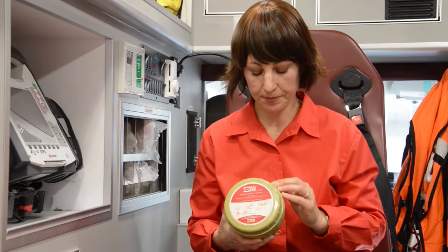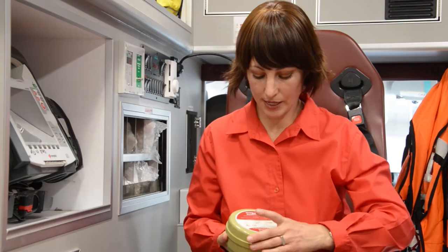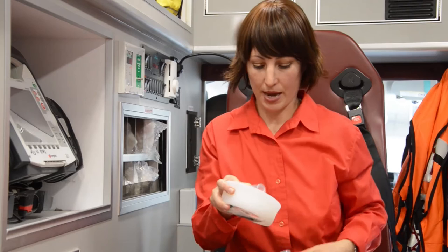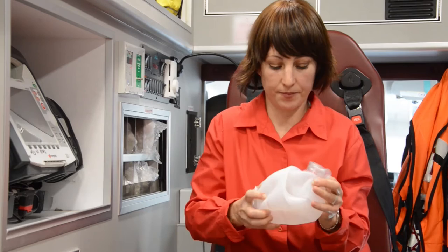The Pocket BVM with O2 comes with an extension oxygen tube. Opening it up is very simple: you just screw open the lid, take off the mask, pull the balloon from either side, and add the mask.